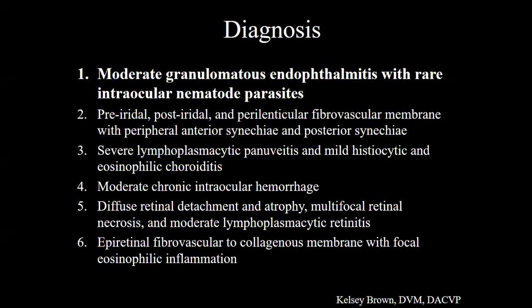All right, and if there are no questions, thoughts, comments? Something here that I think is a mark of Dirofilaria is a very small intestinal profile, which doesn't look like what we have here. It's kind of the opposite. Robust, even in the esophagus, because I wonder if this is more rostral in the parasite, but admittedly, my understanding of parasite features is always a little bit poor. No, I think you did a great job, and I think it is weird limits of how we can recognize that, especially because it disappeared, right?